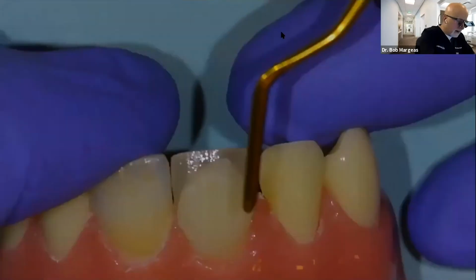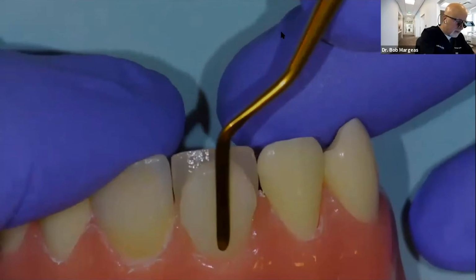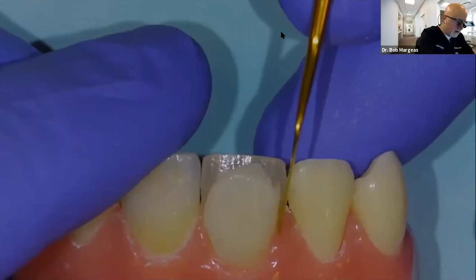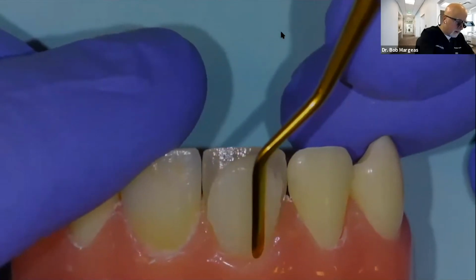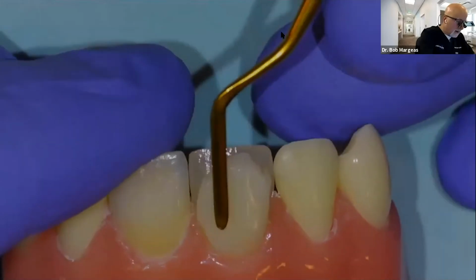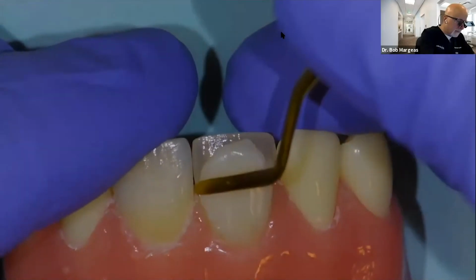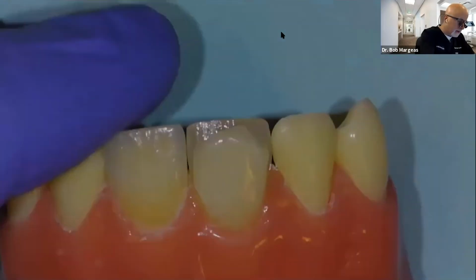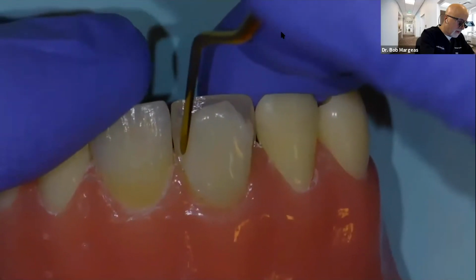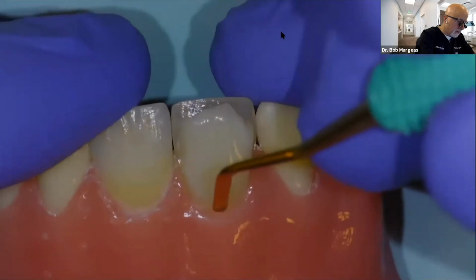So I've got to keep the interproximal clean. I've got to keep this area right here free of any of the chromatic shade. Why? Because I want to maintain the translucency of that adjacent tooth. If I didn't have the translucency, I would bring this material all the way out to the interproximal.